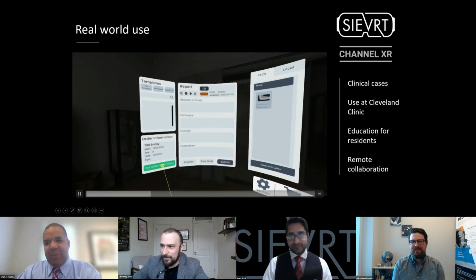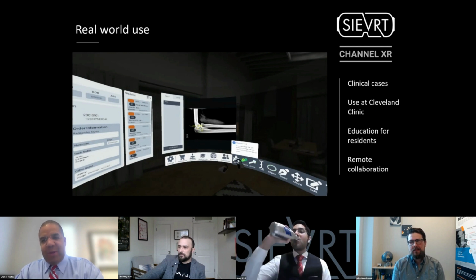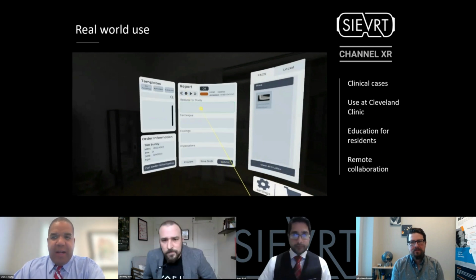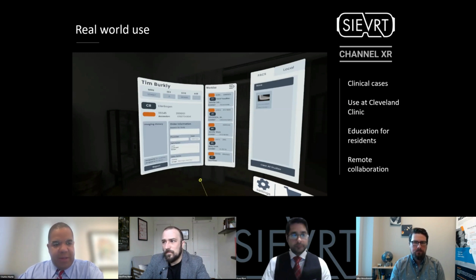Yeah. Thank you for that. I'm sorry to interrupt, but with regard to our study, all of the images that the residents have looked at, Luxsonic has partnered with RSNA, and we have a standardized set of images to allow for a greater degree of consistency with regard to the research study. On top of that, it's allowed us to look at things across different modalities, whether it was MRI, CT, or ultrasound on the headset.